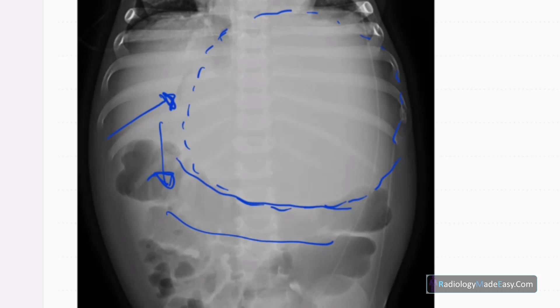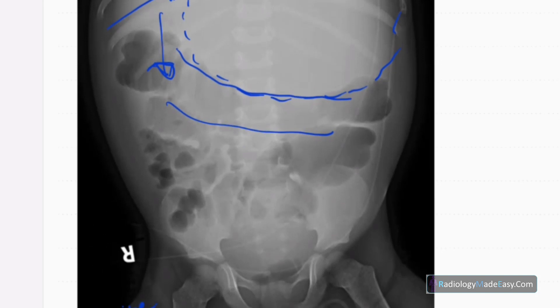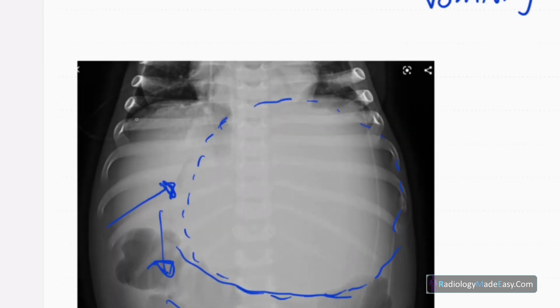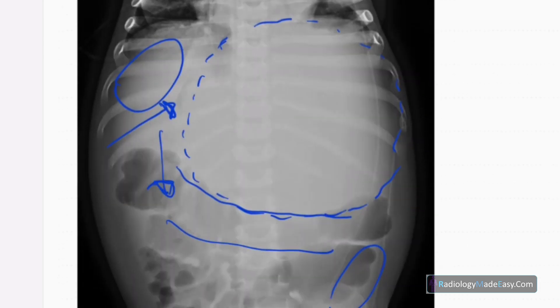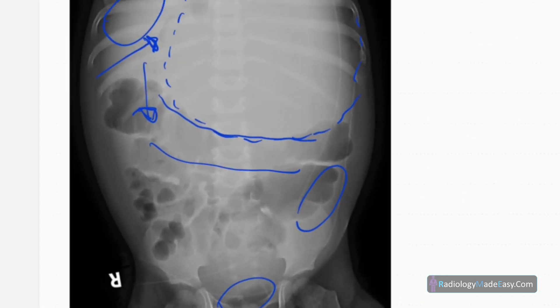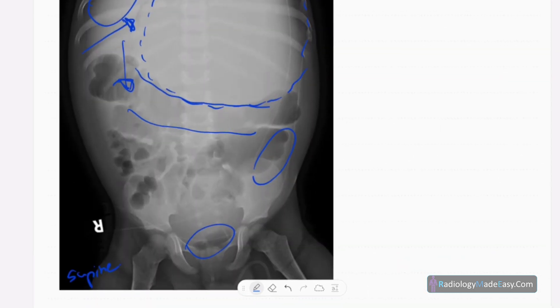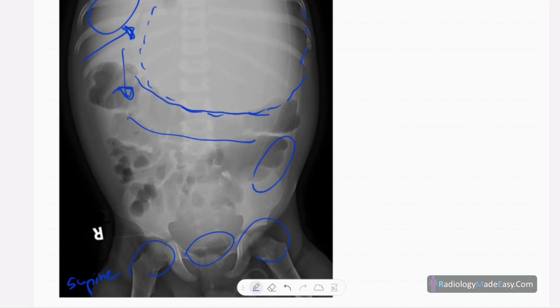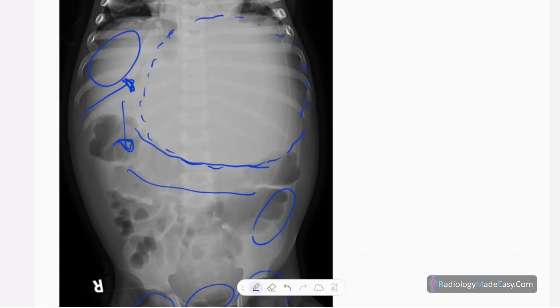However, rectal gas is seen, so there is no bowel obstruction, no intramural gas, no free gas or pneumoperitoneum, no portal venous gas. And you have to see the bones to find out metastasis. So there are no lytic or sclerotic lesions in the visualized bones. Hips are normal and no spina bifida. Vertebral column appears normal and also you don't see high density areas within to suggest calcifications.